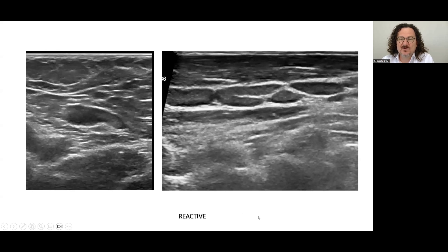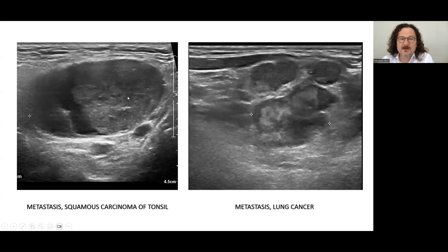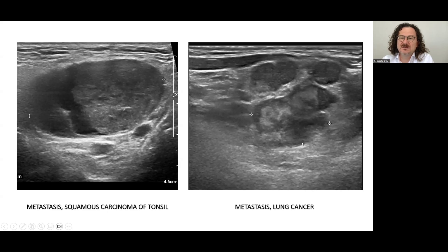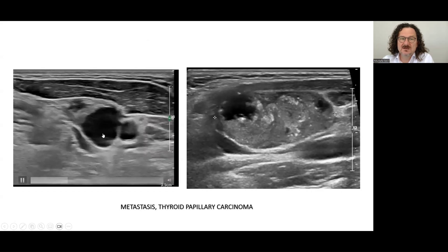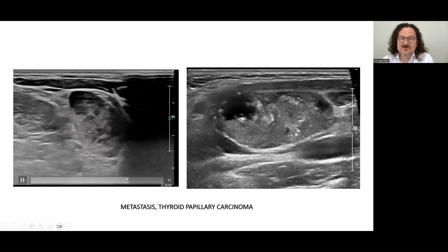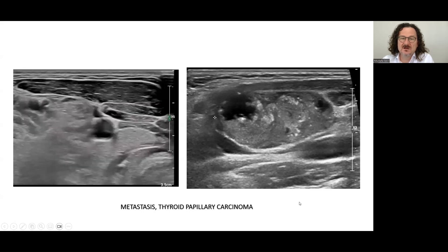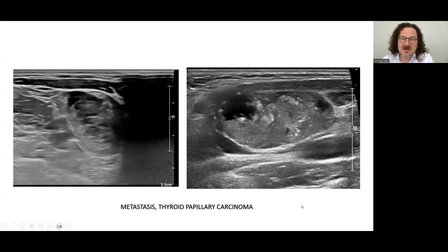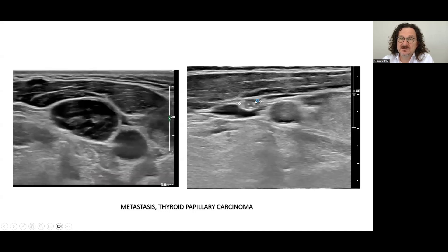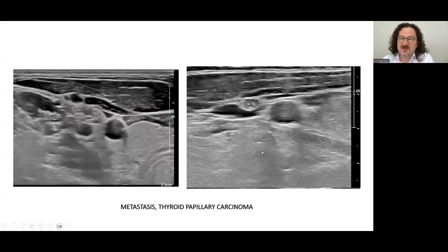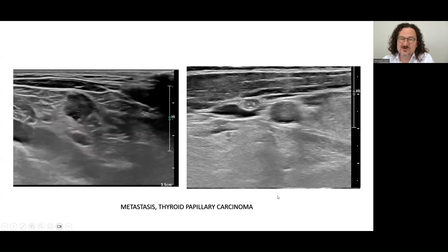You see the ecogenicity of the normal reactive lymph nodes. Inhomogeneous, completely distorted architecture of the lymph node and necrosis area. Hypo-echoic or hyper-echoic mixed ecogenicity lymph node here. Cystic components and hyper-ecogenic foci here — these are quite characteristic of thyroid papillary carcinoma metastasis. Even with this small lymph node, the bright foci here makes the diagnosis of thyroid papillary carcinoma metastasis.